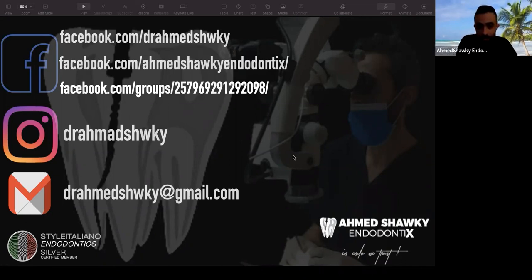How to differentiate between a constricted narrow and a calcified canal? Okay, calcification starts from the area of initial irritation. So our irritation in endodontics is caries, the dental caries, and the caries comes from the coronal part. So if you have a calcified tooth, you will find the pulp chamber maybe narrowed, maybe having a pulp stone, and maybe totally obliterated. So calcification starts from the source of irritation downwards. So when we solve calcification, we use ultrasonic until we reach the patent part. This is a calcified canal.